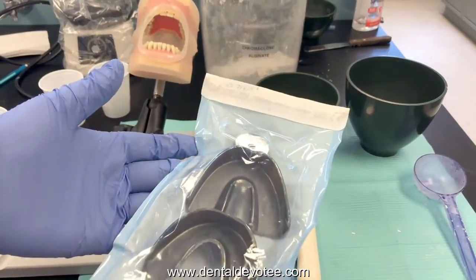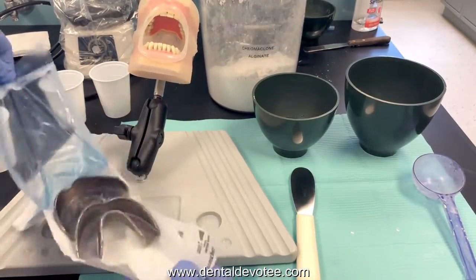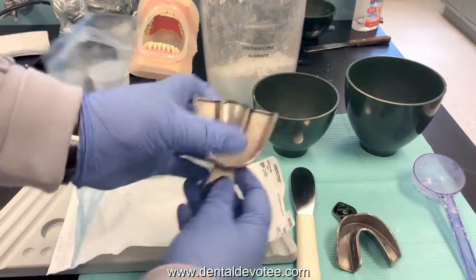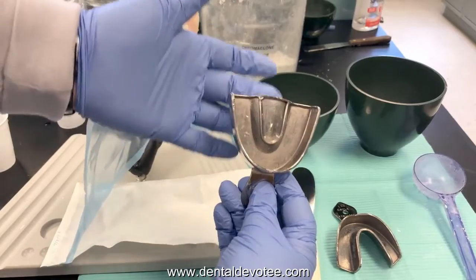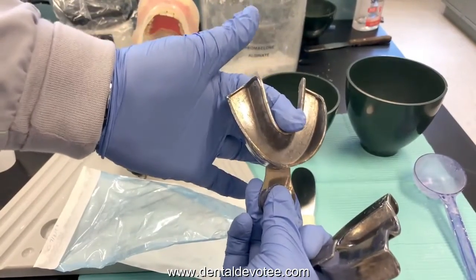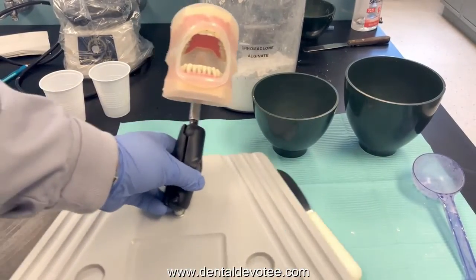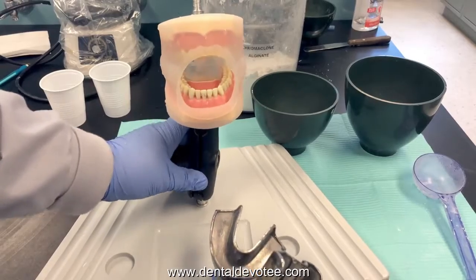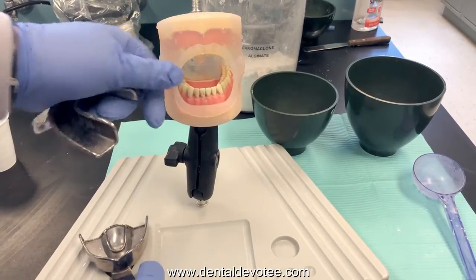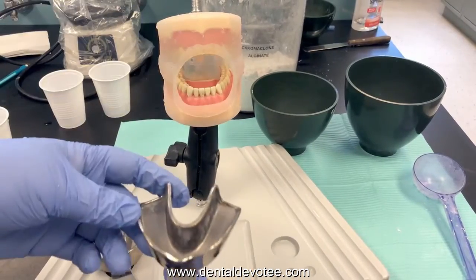I already know these trays will fit because I've done this on the mannequin many times. Open up your trays. The maxillary tray is solid across the palate; the mandibular tray is U-shaped with room for the tongue. Those are the two different trays to try in. Using a mannequin with cheeks makes it a little more realistic, but they are clear so you can see what's happening inside the cheeks.